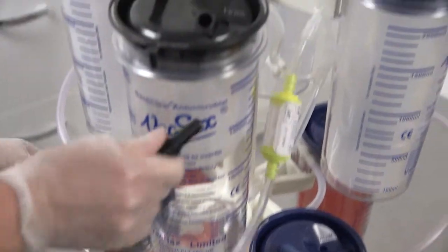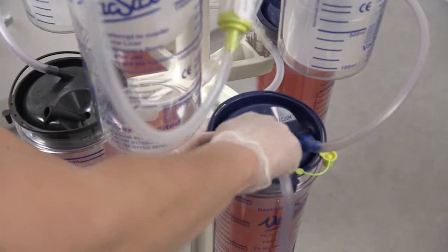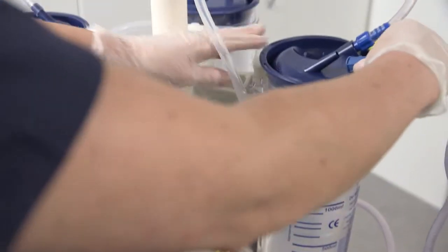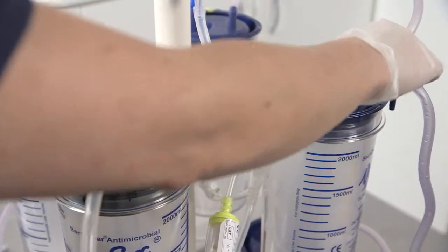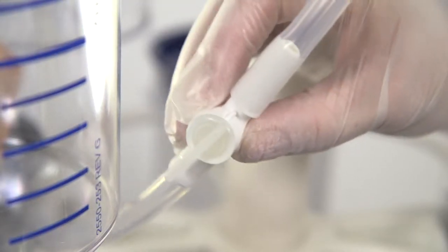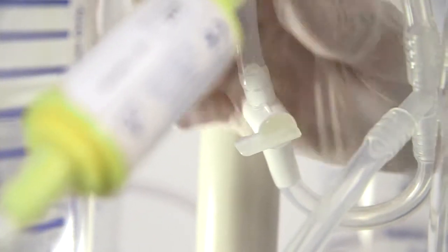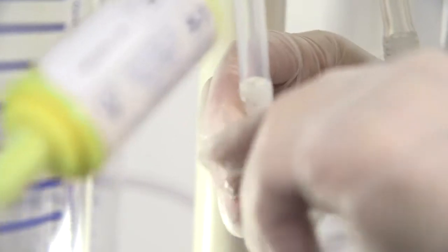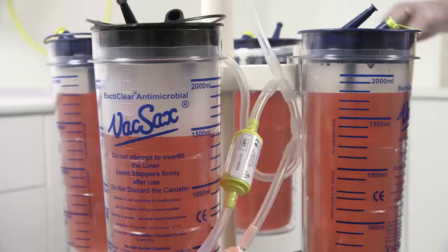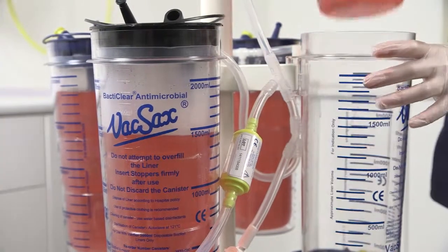Once the bottom row of liners have filled, reverse the earlier process by moving the black vacuum tapered connector to the top black lid liner and the patient tubing to the top blue lid liner. Now close the bottom siphon tap and open the top siphon tap. Using the convenient handles on each liner, repeat the earlier shown process and start to remove the liners from the canisters.